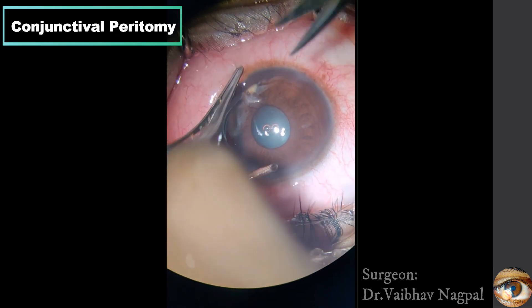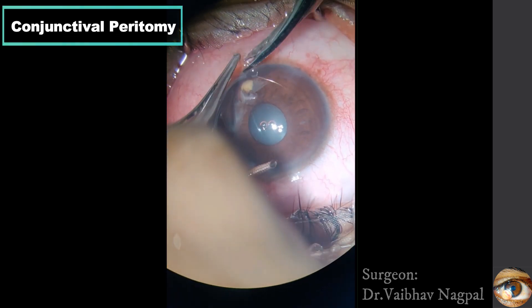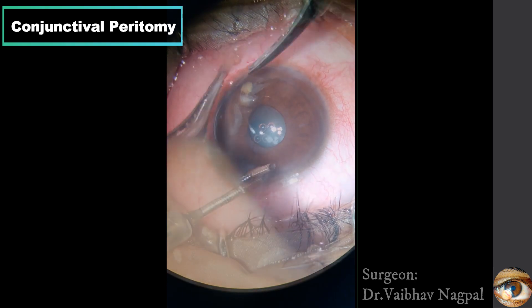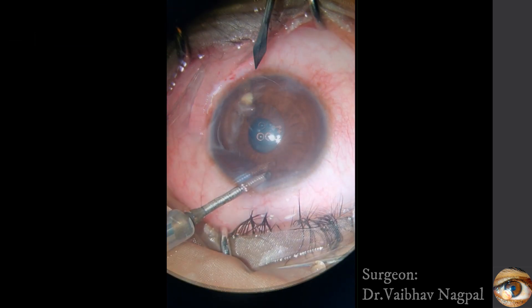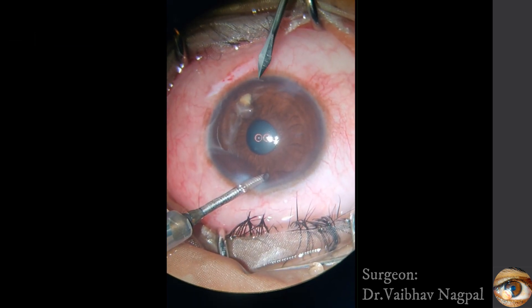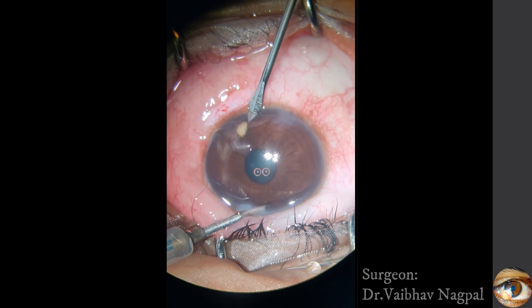A conjunctival peritomy is done for a future limbal incision. A clear corneal incision is made for the entry of intravitreal forceps.